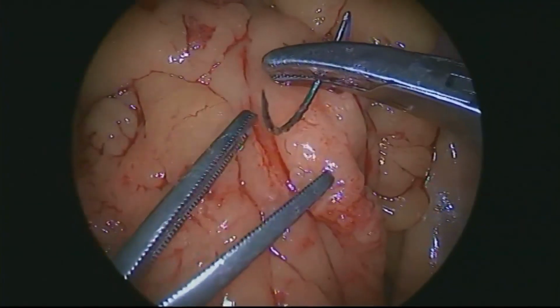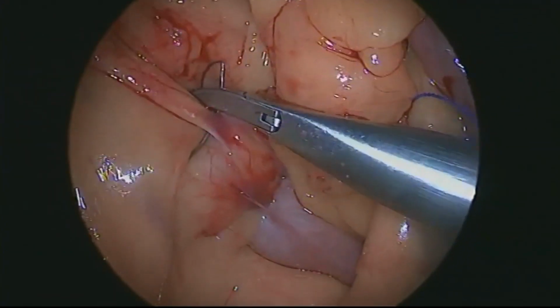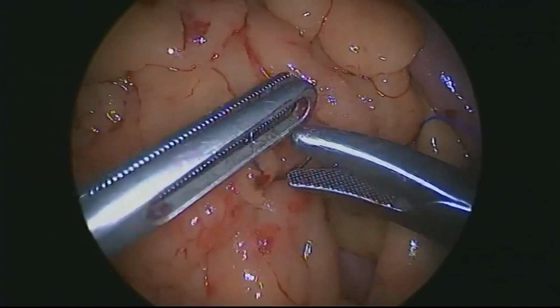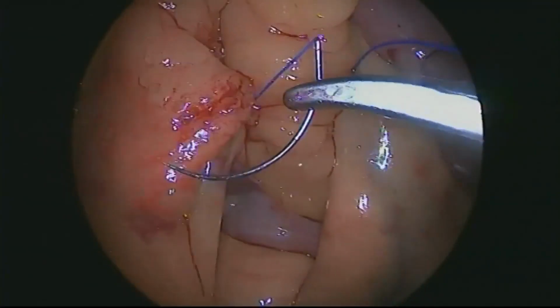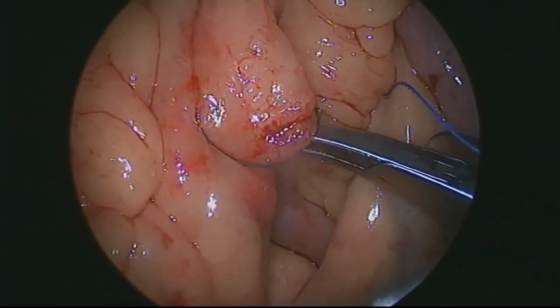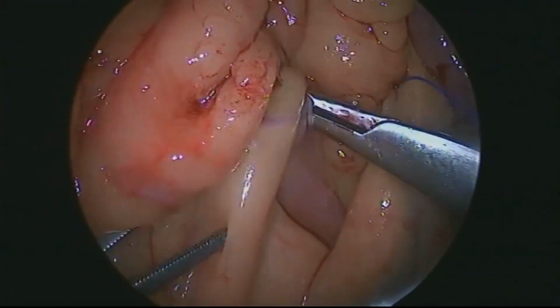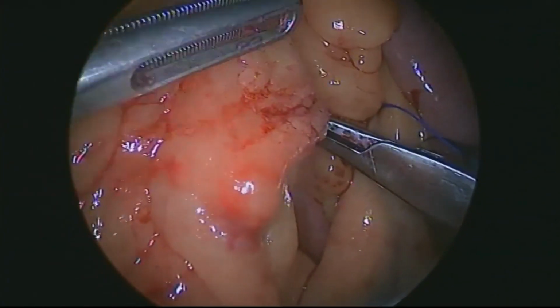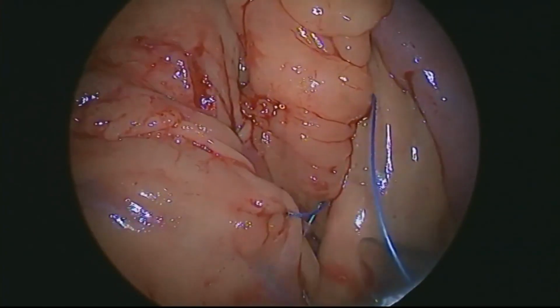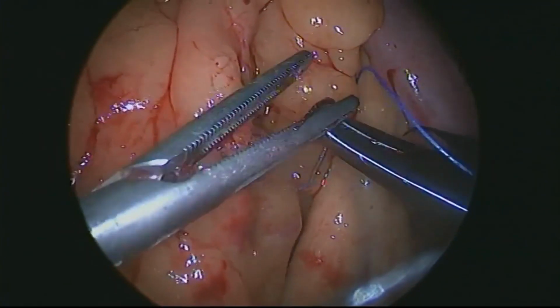Usually we can even incorporate the ligament of Treitz, not always, but here we get to the root of the transverse mesocolon, and here you see how that flimsy ligament is being incorporated in this suture. So here's the root itself of the transverse mesocolon, where it gets its transition towards the mesentery of the small bowel.